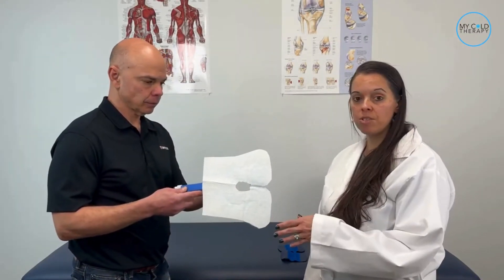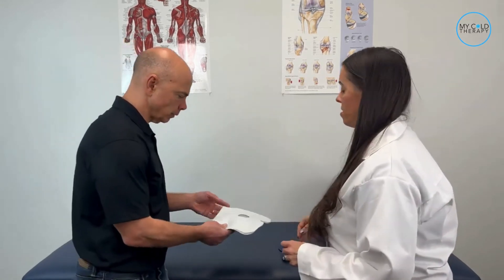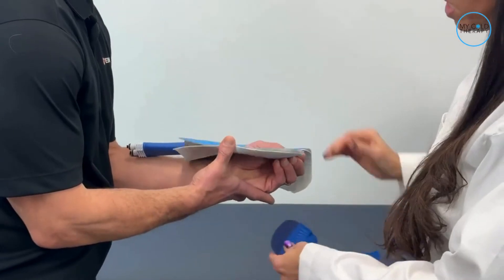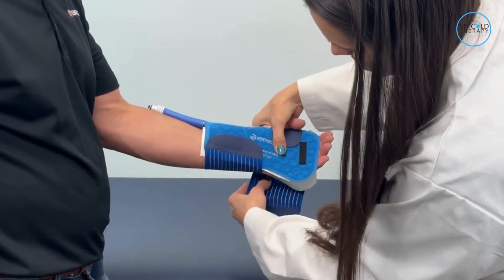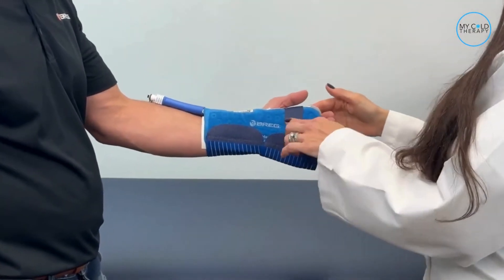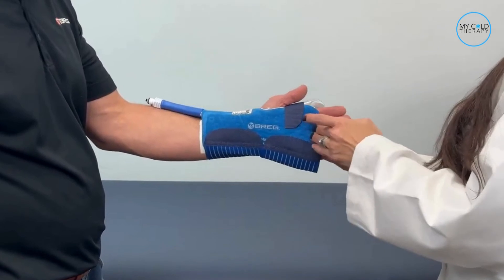As you can see, our sterile dressing is in place. We trimmed the sterile dressing to make it fit the pad better and also cut out the centerpiece, which is where your thumb is going to go. So first, you're going to put your thumb through the center. Then take your two straps and attach one to the back side and one to the front side. Do the same thing with the second strap. Once it's on there and fastened securely, this little built-in piece is actually used to connect the front and the back to keep it closed.